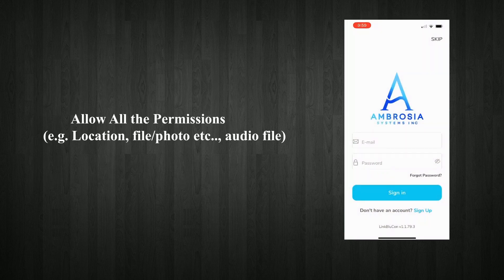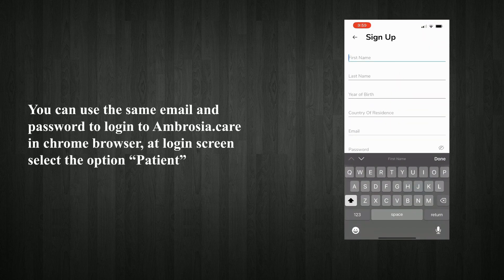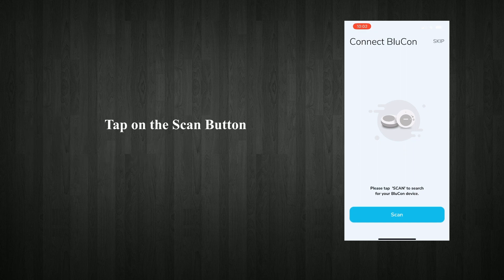Allow all the permissions: location, file or photo, etc. Open the LinkBlucon application and log in. Open the LinkBlucon app menu and scroll down. Tap on the scan button.